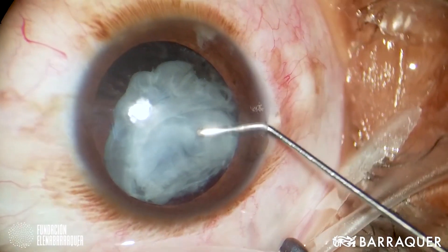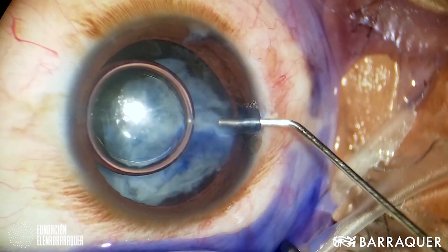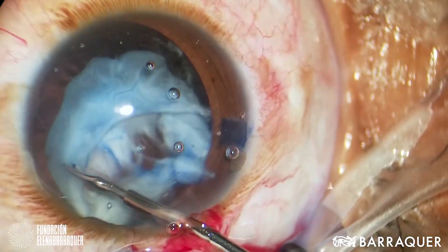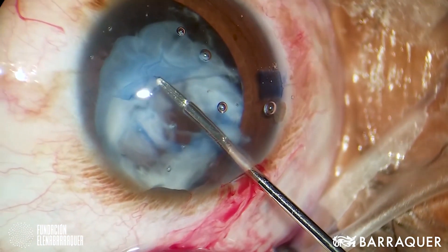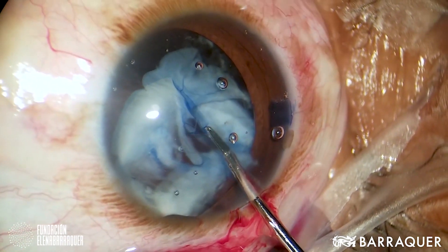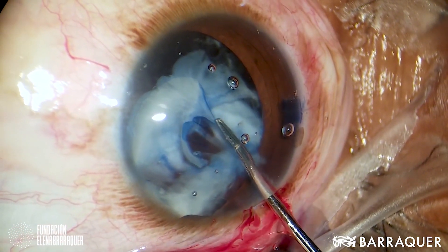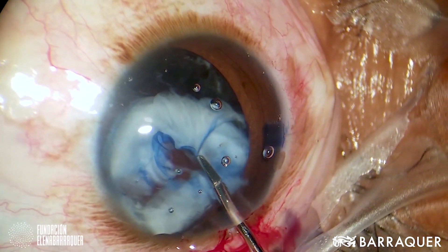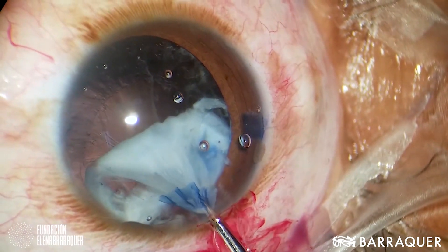The next case shows a traumatic cataract with partial loss of the anterior capsule, as we can perfectly see once we have injected Vision Blue. We complete the anterior capsule with scissors and forceps, always remembering that these mature cataracts have weak zonules and it is not convenient at all to pull on them. This last part was fibrosed and I completed the capsulorexis with scissors. Once this was achieved, the rest — since it was a traumatic cataract — was easy to aspirate.